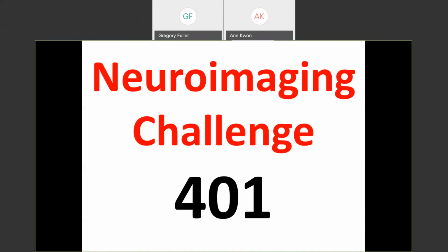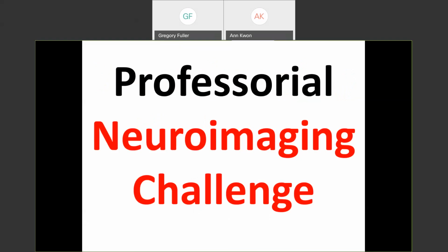Okay, I put that one in the middle. All right, you want to move on up to 401, like senior level? All right, let's try a neuroimaging challenge 401. You ready? Chat in with your answers. Here we go. Oh, actually, sorry. I decided in retrospect, we're going to bump it up more than a 401. We're going to make it professorial, like a professor. Faculty level, so faculty are eligible to play. But this is why everyone has to have something in this conference that they get right to feel good about themselves, because I'm all about that. But everyone also needs to be challenged, so we try to challenge the faculty as well.